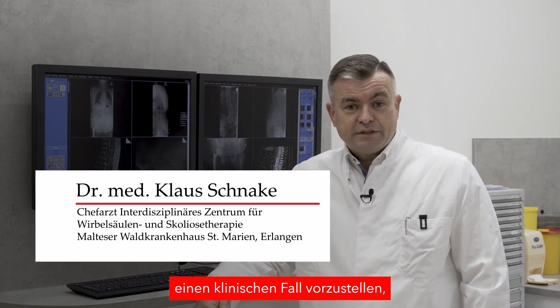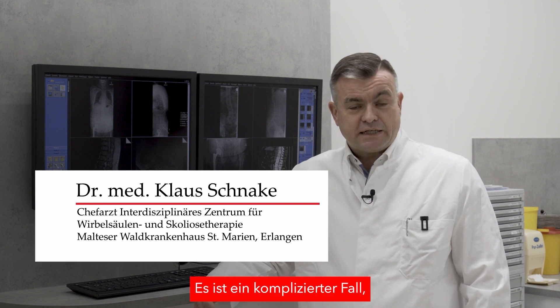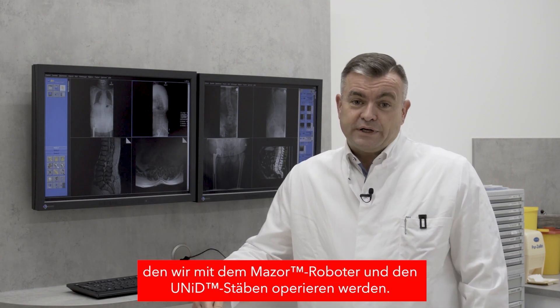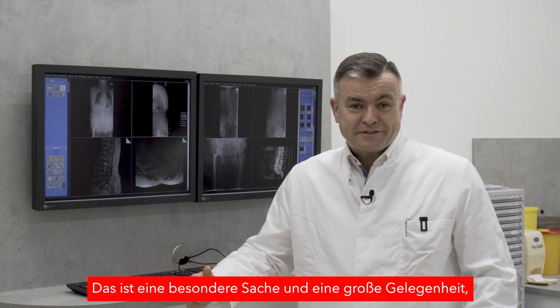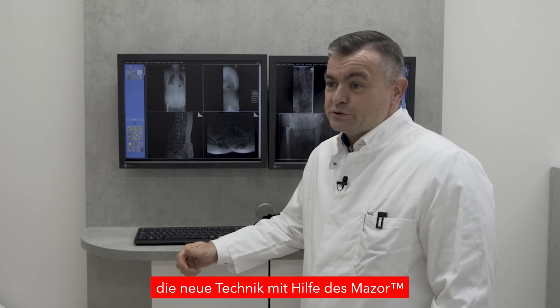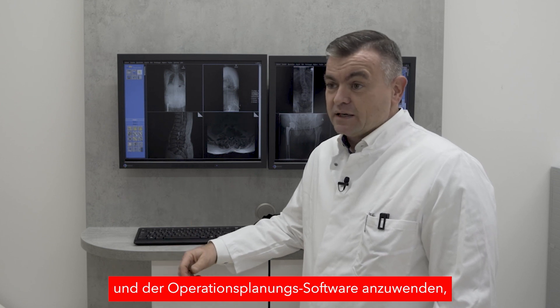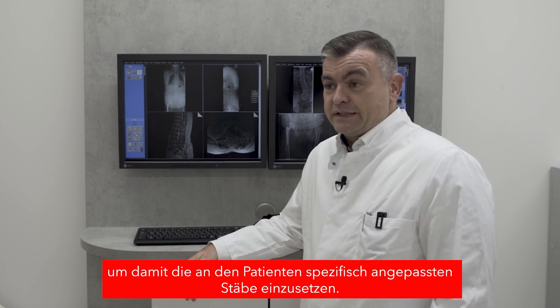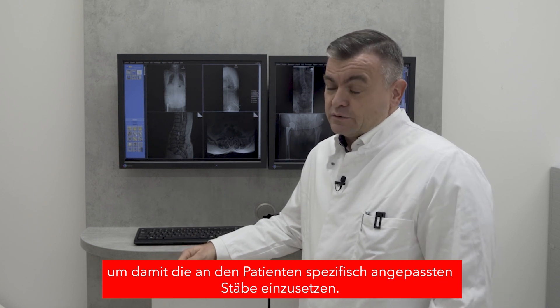It's a pleasure today to introduce a case which we are going to operate tomorrow. It's a kind of difficult case we are operating with the Mazor as well as with UNiD rods. It's a great opportunity to check the new technique with the help of the Mazor, the pre-planning software, and the patient-specific and adapted rods.